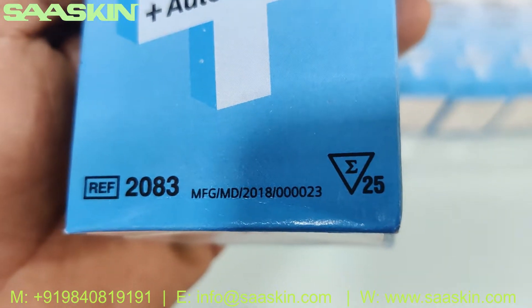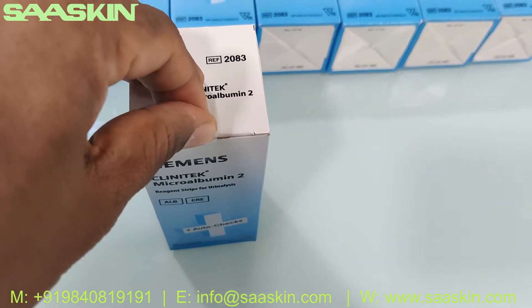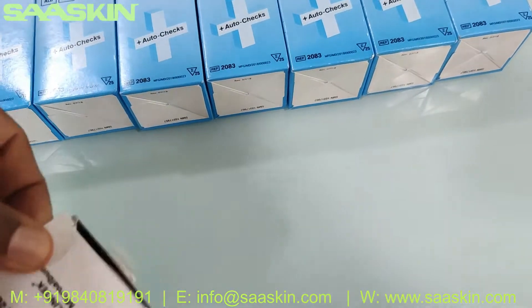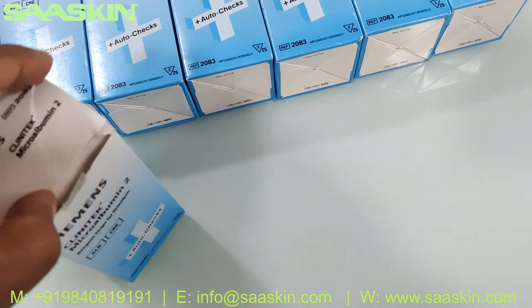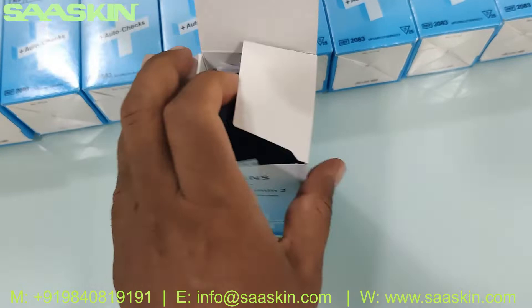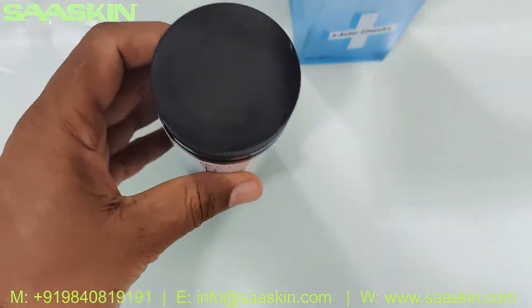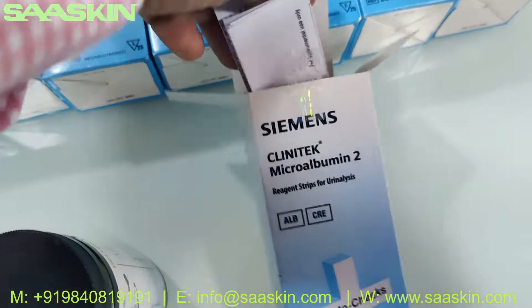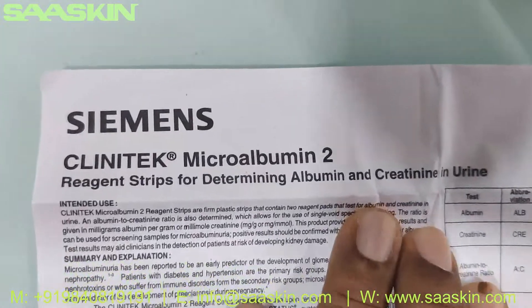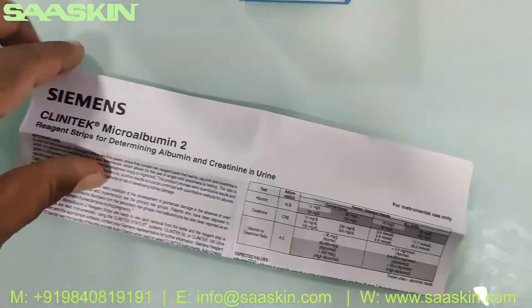You can see there are 25 strips. Let me open this for you. Inside the box you get the bottle and you also get the IFU brochure, which is a complete brochure for the Siemens Clinitek microalbumin urine strips for determining albumin and creatinine in urine.